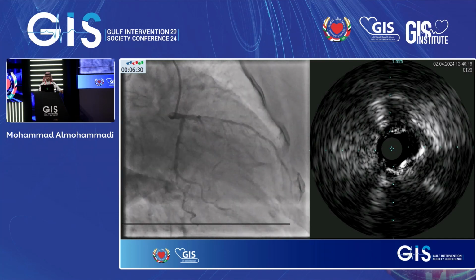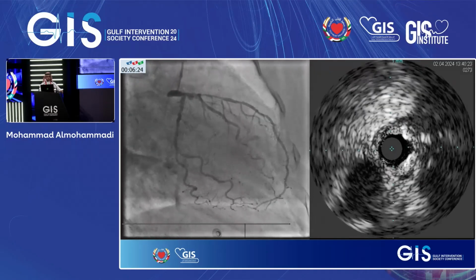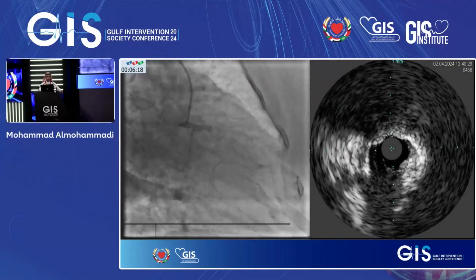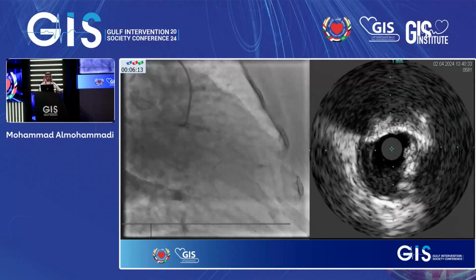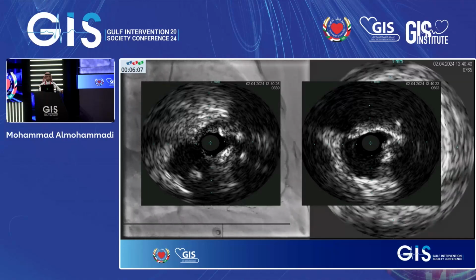This is her IVUS, and the IVUS was stuck in an area in the proximal to mid-LAD. But if you pull back the IVUS, there is some calcium nodule around the bifurcation here, and then as you go into the proximal LAD, you see more of an irregular-shaped calcified nodule, as we just saw. This is the still image with it for the right side.